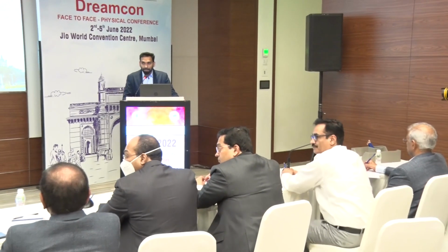Almost around 92% of KOH mount we were able to diagnose with fungus, and if it's a cultured medium, we have got 100% sensitivity on getting the hyphae. We also published three other articles on the same things of how IOLscope is used to diagnose fungal hyphae and parasites also. So no, sir.